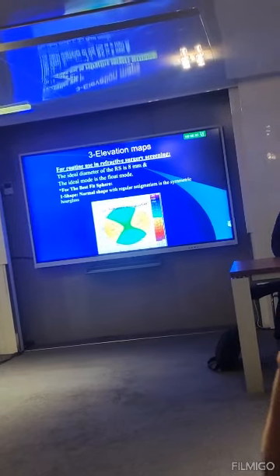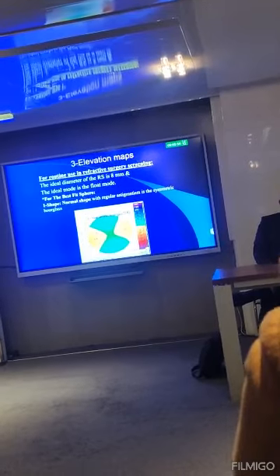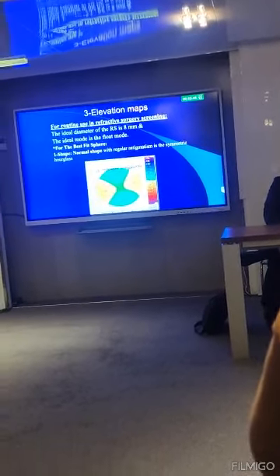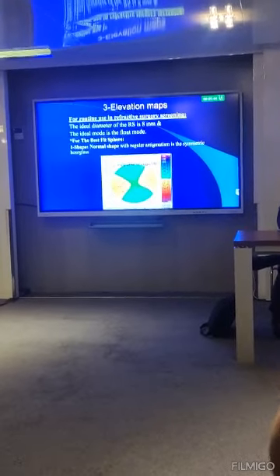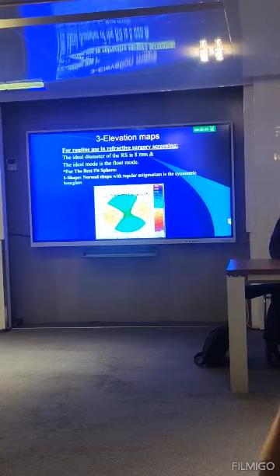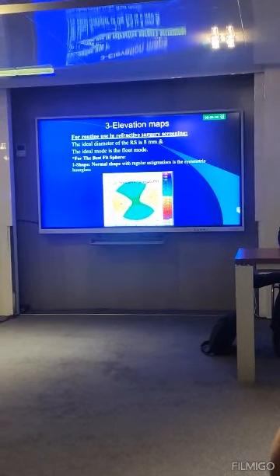For elevation maps for routine use we can use the best fit sphere. It has some value, but of course the most accurate for keratoconus is the best fit ellipsoid. Best fit sphere can give the normal shape. Its normal is a regular astigmatic symmetric hourglass. Just to remind you, in the topography we say a symmetric bow tie. In the elevation we say a symmetric hourglass.